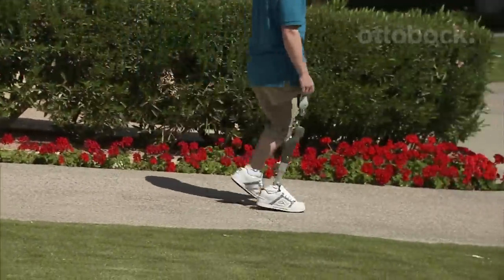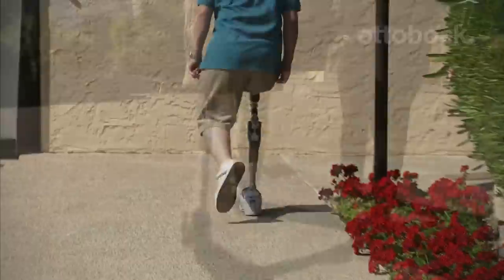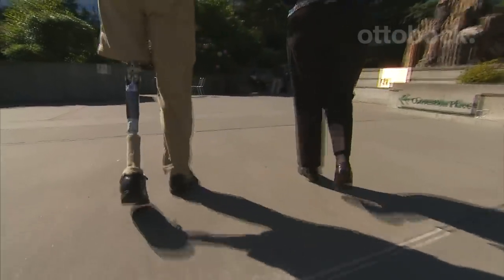The hydraulic control provides resistance when needed and allows the hip joint to move freely when needed, mimicking the muscle control of the human hip joint. This provides smooth control of the hip joint throughout the entire gait cycle.